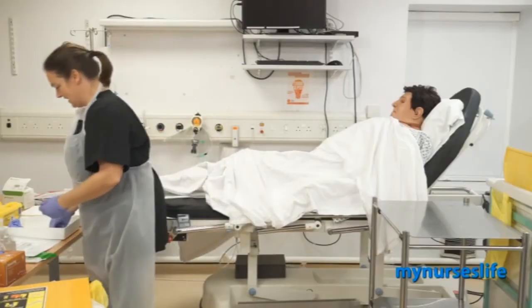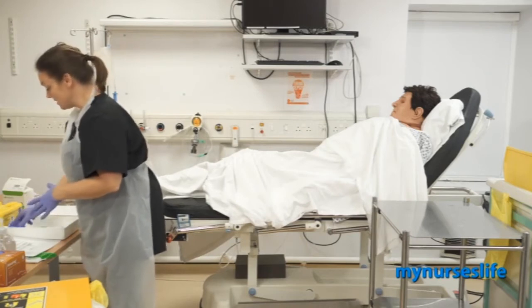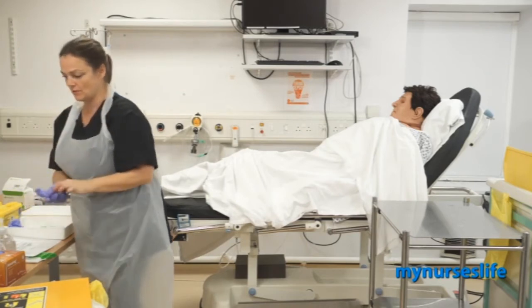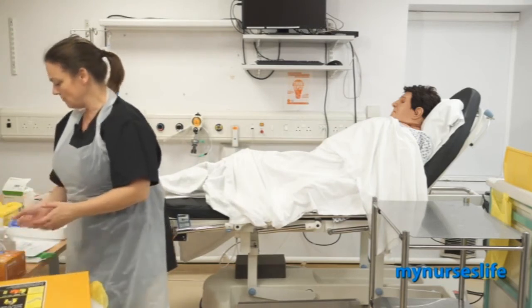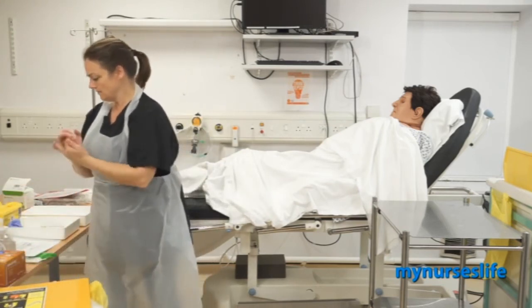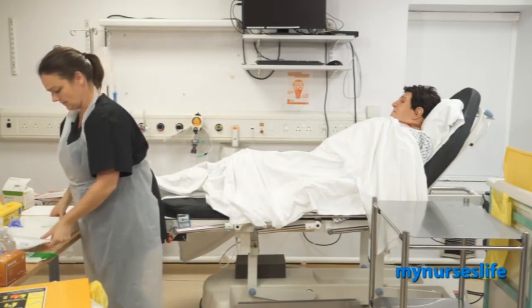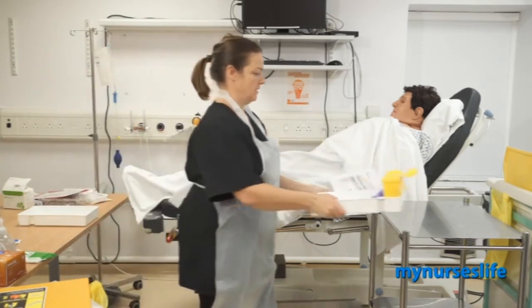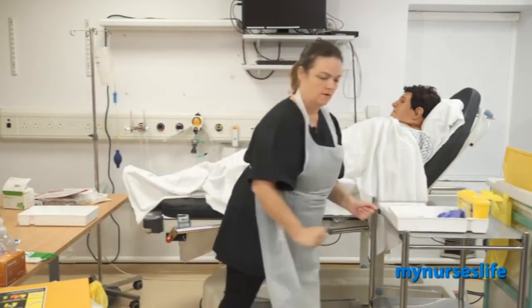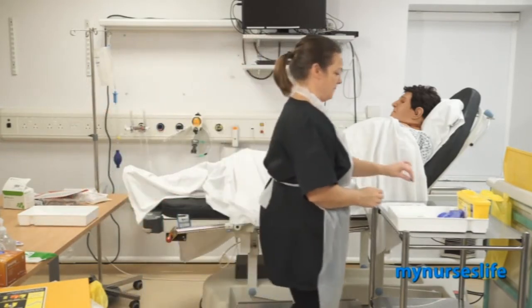Okay, so I will go to the patient. I'll take the medication with me because we always take the injectables with us when we go to the patient. And take those gloves off. Gel my hands again. I'm going to return to the patient now. So, just going to get my pen to sign with. So I'm back again, Emma.